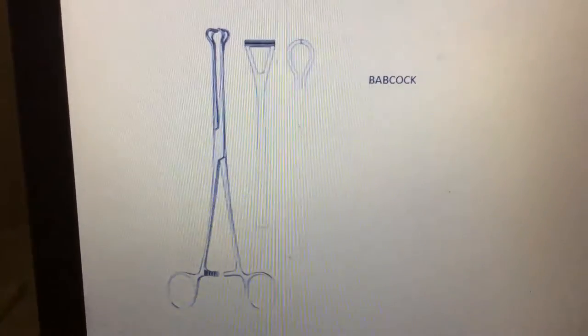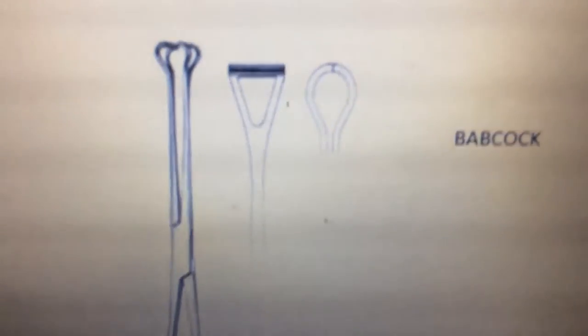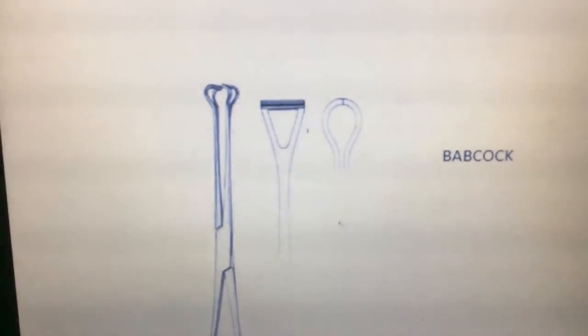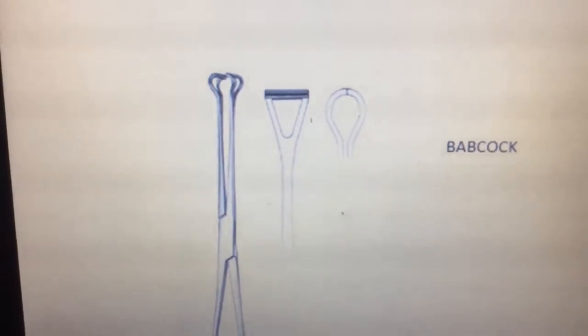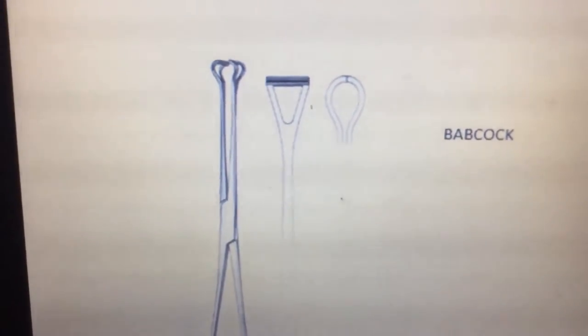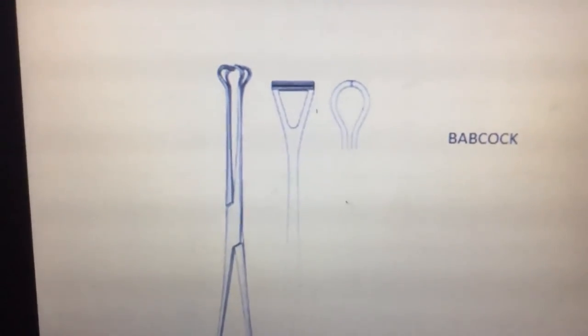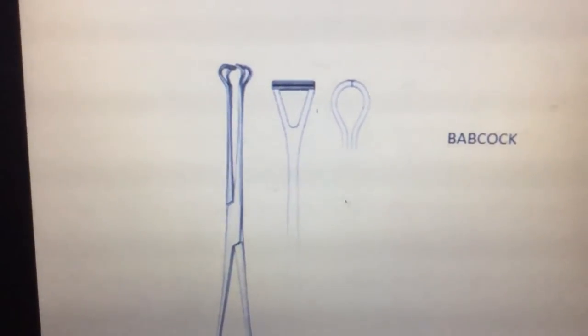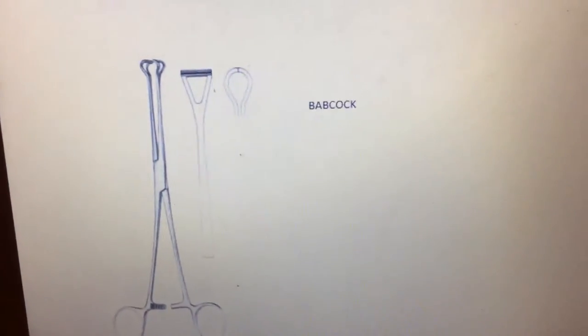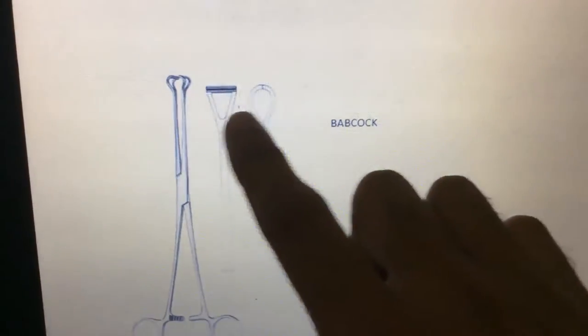Next, this one is the Babcock forceps. Babcock forceps are mainly used to grasp delicate tissue or hold hollow organs like the fallopian tube or ovaries. The tip is a triangular or oval shape.